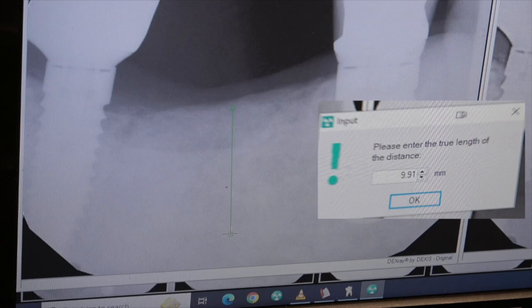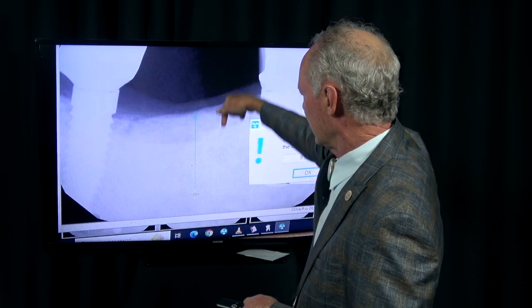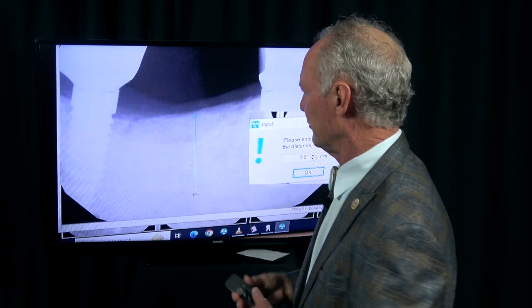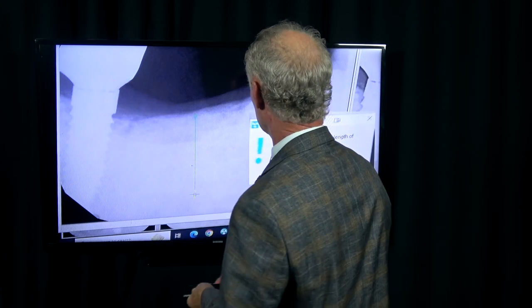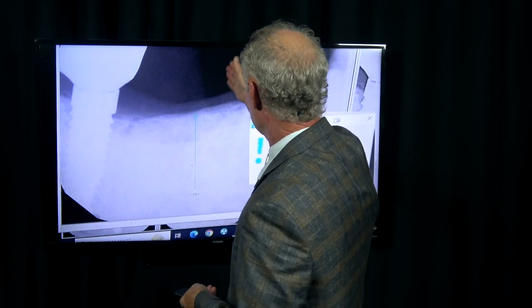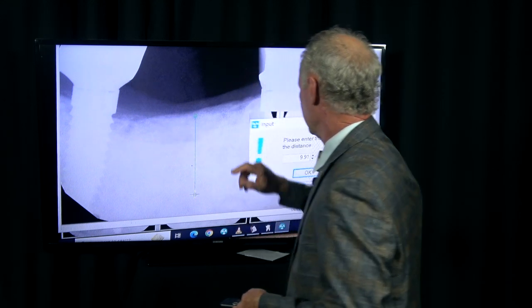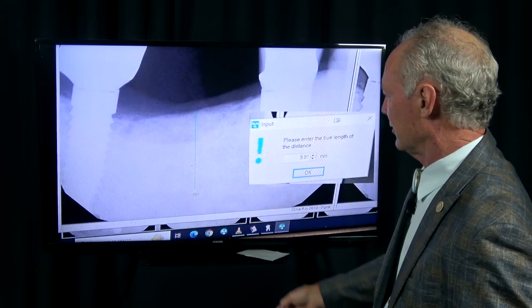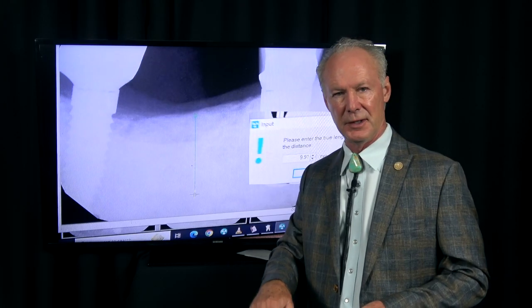Decide which of the teeth adjacent to it you want to use as a guide for the angulation of the implant. You can see the molar tooth implant is angled forward a little bit, so I've got to judge the ideal angulation between the two teeth. I'm going to primarily use the bicuspid as a guide for the angulation.